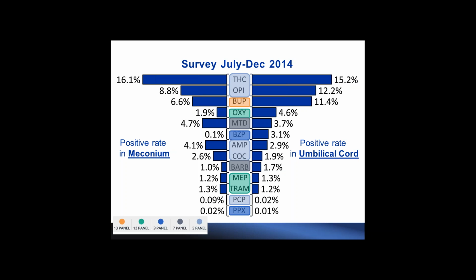Thank you, Dr. Shu. Another question that arrived is, what is USDTL's turnaround time for meconium and umbilical cord tissue drug samples? Turnaround time, if the samples are negative results, meaning not reaching our cutoff, it will be released within 1 day. And that is for general drug classes like I show on this slide.